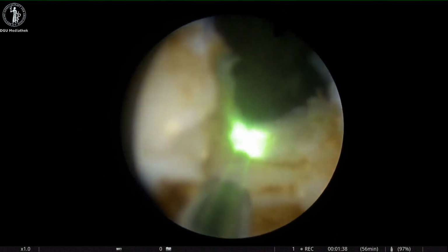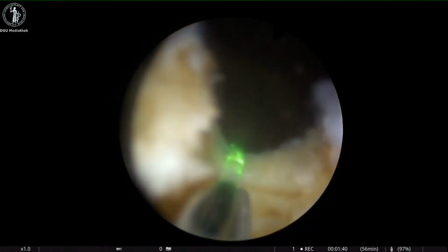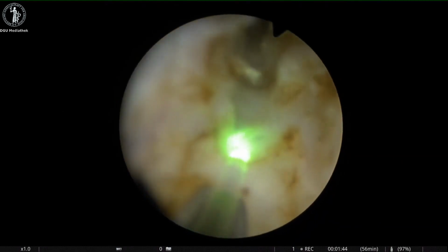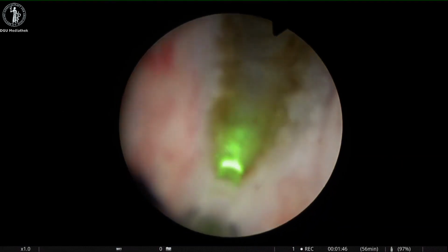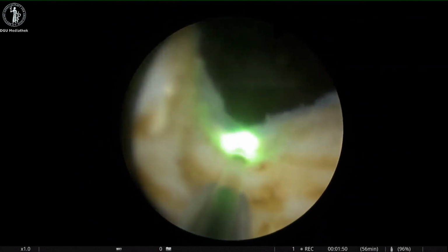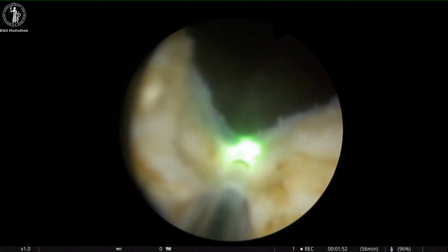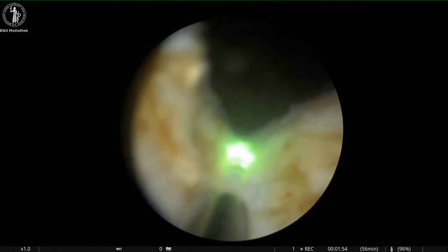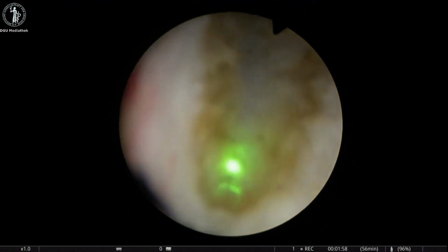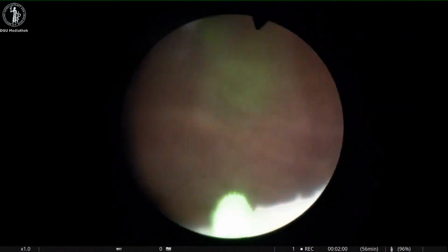Particular attention is paid to retain a strip of mucosa between the 2 incisions. The strip of mucosa builds the basis of re-epithelialization of the healing wounds and prevents scar tissue formation again. The prostate capsule can easily be identified here.